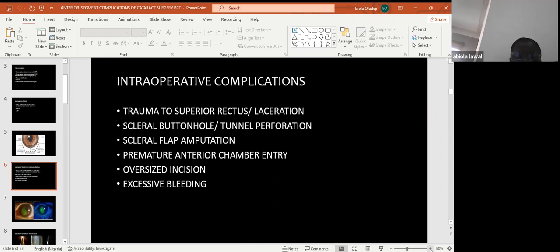You need to gently handle your tissue and try to avoid the big, obvious conjunctival vessels. And if this happens, a gentle cautery will suffice. But if you don't have cautery and the bleeding continues, and you make your incision into the AC, it can flow into the AC, obscure your view, and lead you to unnecessary complications at that stage.